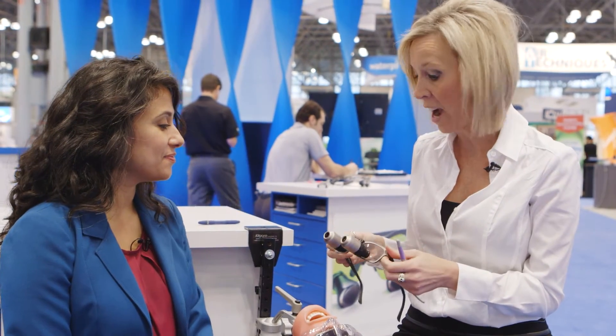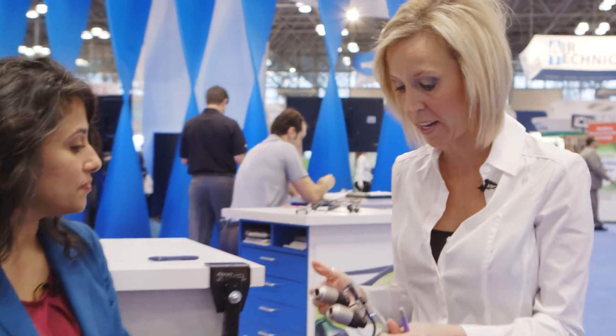I'm very surprised at how light they are. I like the fact that they're able to be customized according to my eyes.